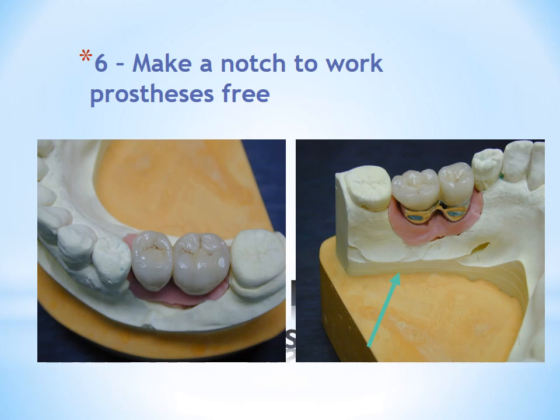Make a notch to work the prosthesis free and reposition it.